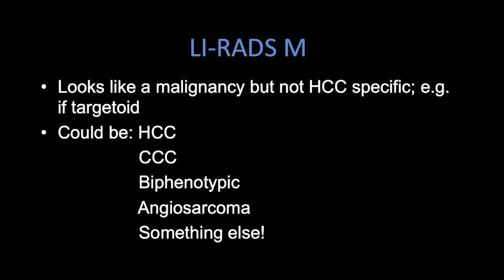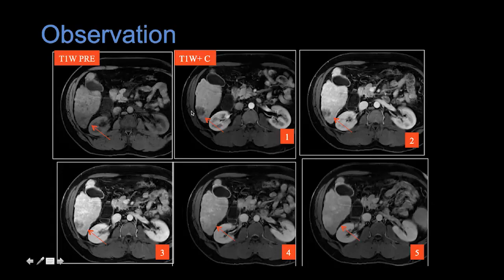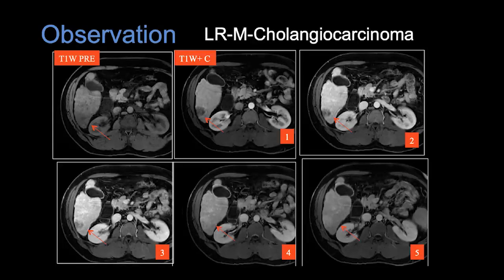LIRADS-M basically says: I am a malignancy, but I am not definitively HCC. It could be an HCC, could be a cholangiocarcinoma, could be a biphenotypic tumor, could be an angiosarcoma or something else. We need to say we don't know, but we're very concerned this represents malignancy. In another patient with the same concept in a cirrhotic liver, we have a focus of abnormal signal intensity in segment six on T1 and T2, with rim-like progressive enhancement that completely fills in on delayed phase — imaging features that do not meet diagnostic criteria for HCC. This is also a patient with a cholangiocarcinoma.